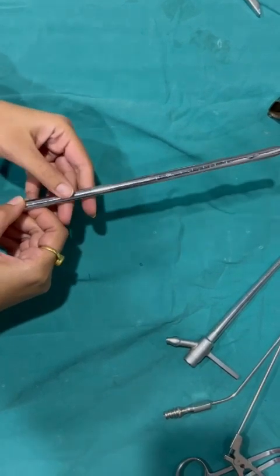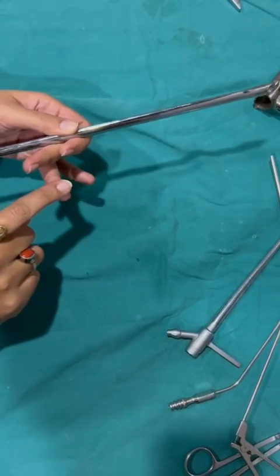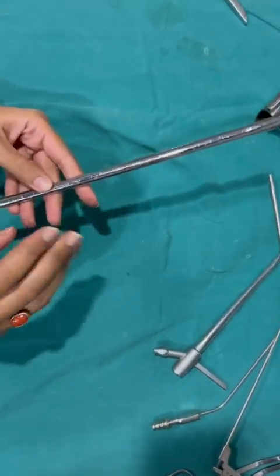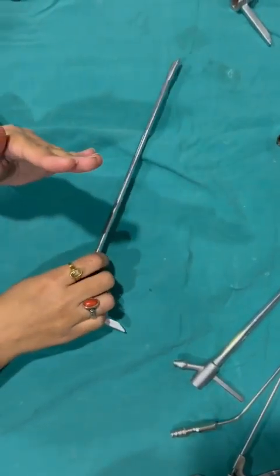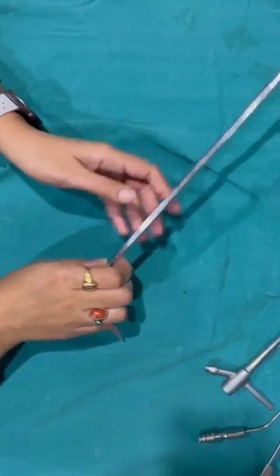The contraindications are trismus, which makes the procedure difficult, receding mandible, etc. The position of the patient should be supine with head elevated by 10 to 15 centimeter, neck flexed on the chest, and head extended at atlanto-occipital joint.